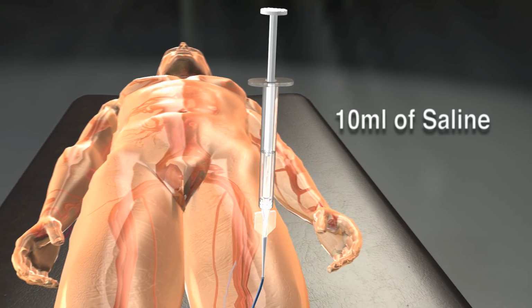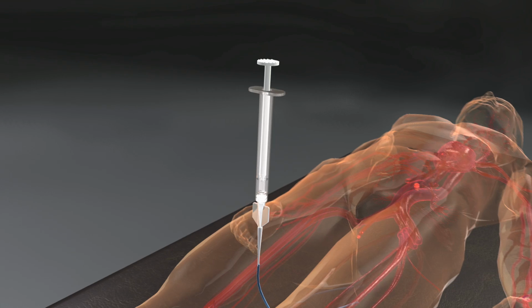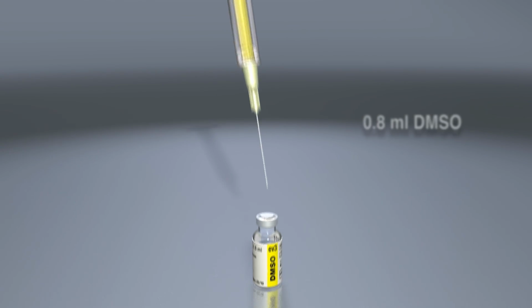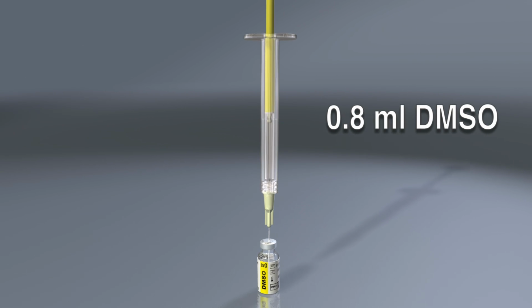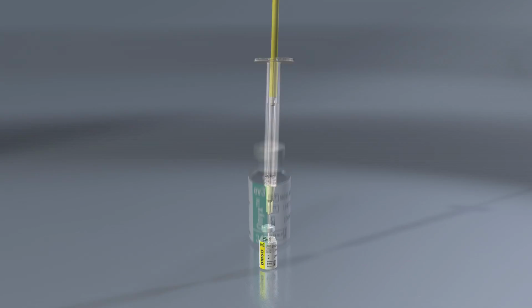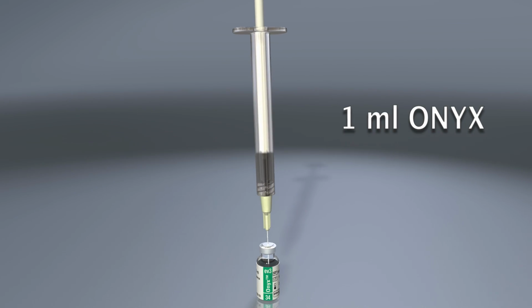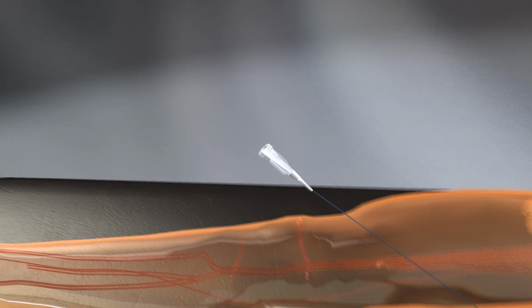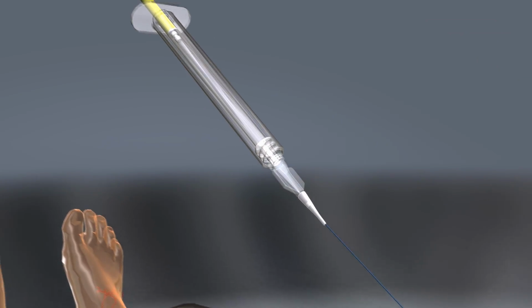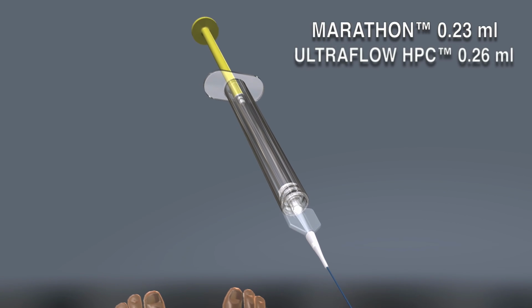Flush the contrast from the microcatheter with 10 milliliters of saline to expel the contrast media. Leave the syringe connected to the catheter. Aspirate approximately 0.8 milliliters of the supplied DMSO into the yellow 1 milliliter DMSO syringe. Next, aspirate exactly 1 milliliter of the mixed ONYX into the white 1 milliliter ONYX syringe using an 18 or 20 gauge needle. Connect the yellow DMSO syringe to the delivery catheter and inject the DMSO in sufficient volume to fill the catheter dead space.